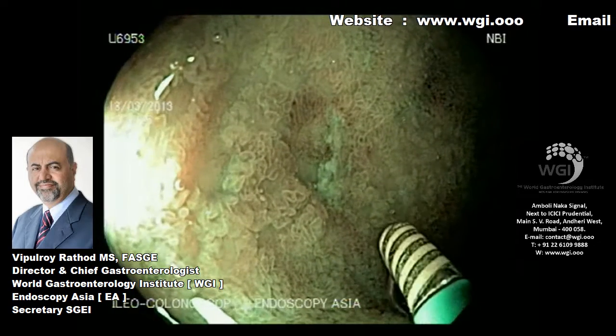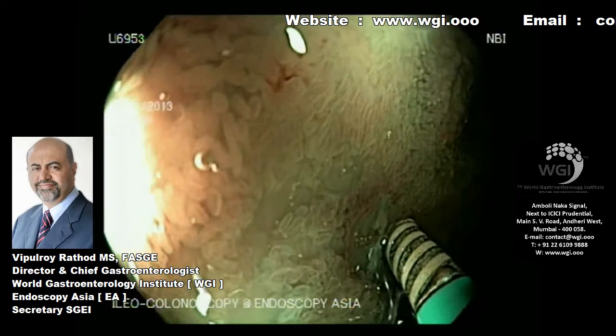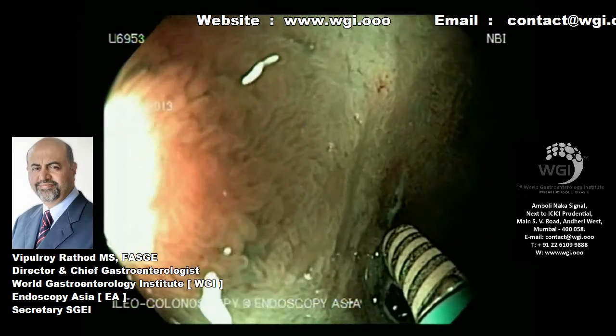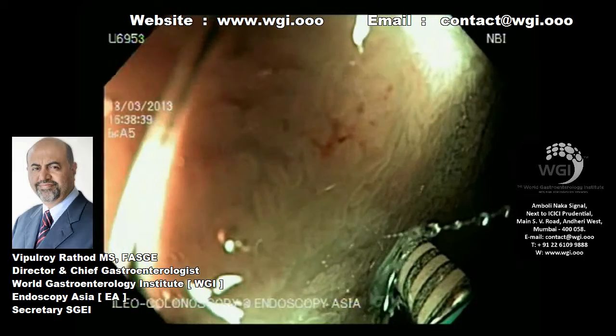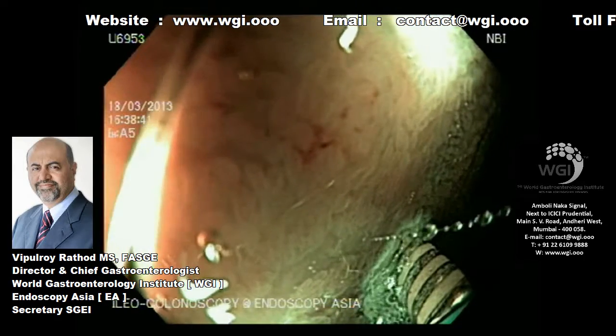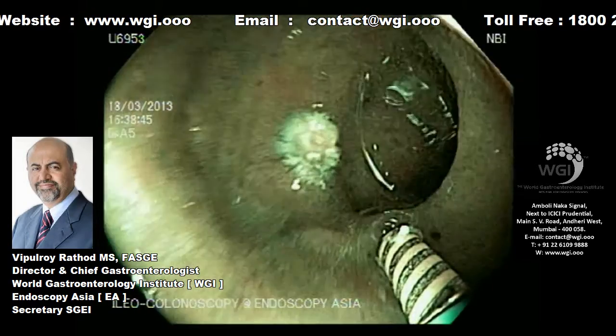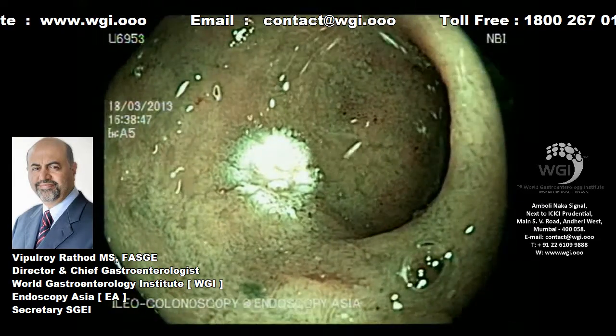This is exactly what we're doing now with a bipolar heater probe, and we will fulgurate the bleeding vessel successfully. We don't recommend a monopolar probe, as there is a high risk of perforation in the ileum, and this should not be practiced at all in the current setting.